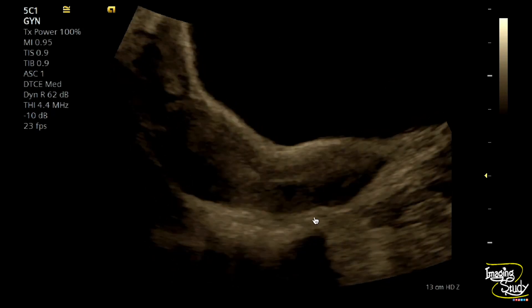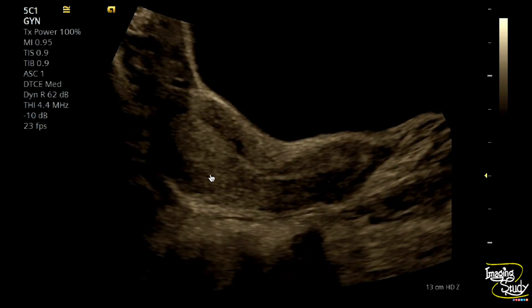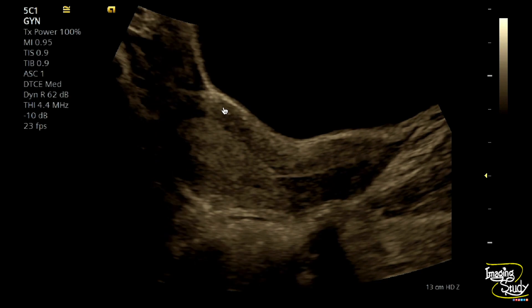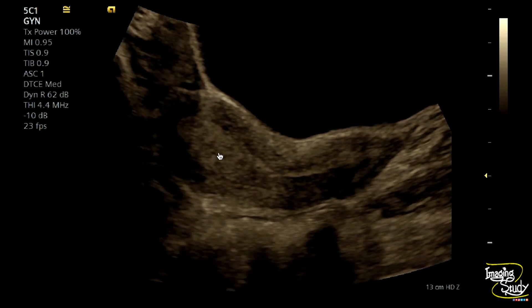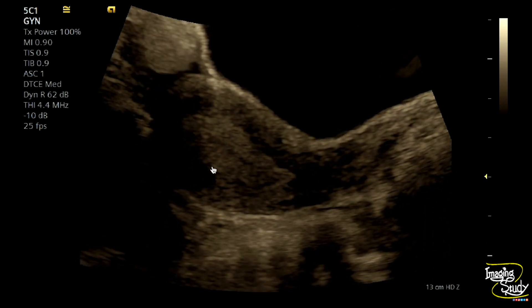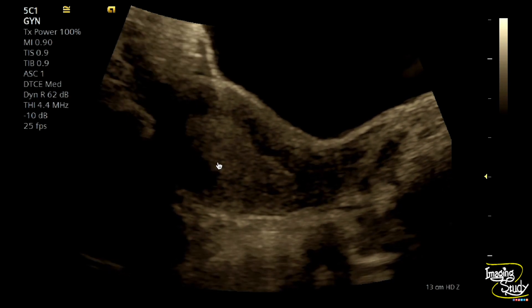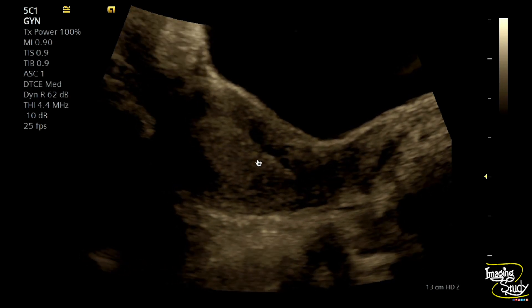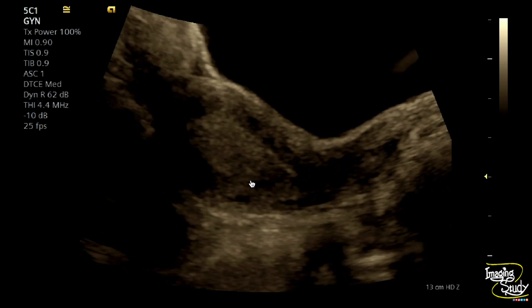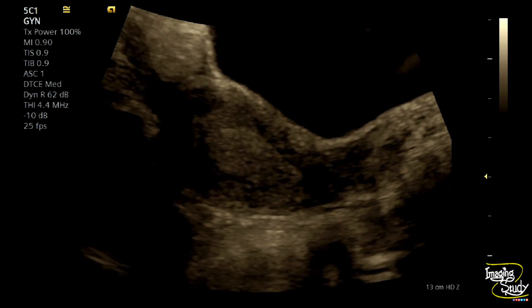Here you can see the longitudinal section of the uterus. You can see the endometrium is slightly prominent. If you check carefully, you can see some motility within the endometrium. There is a movement which is well visualized here. This wave-like motility can be seen during the normal menstrual cycle.